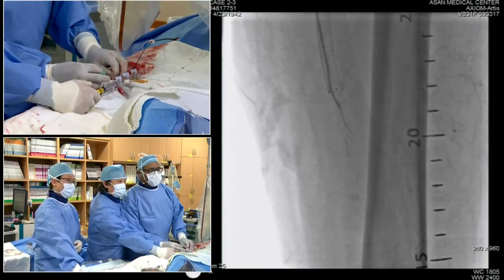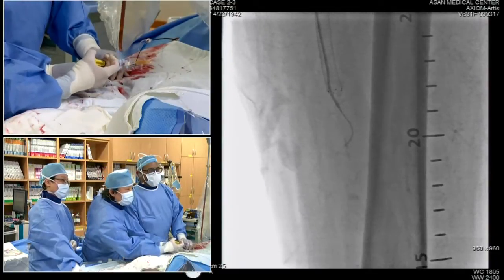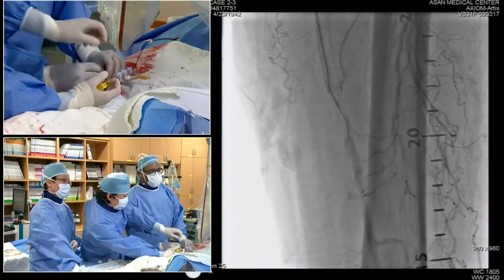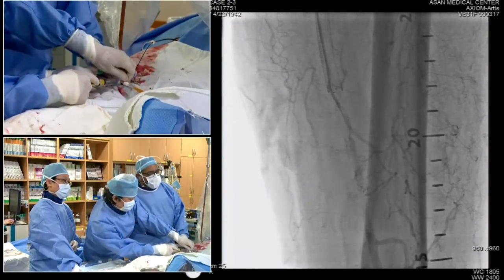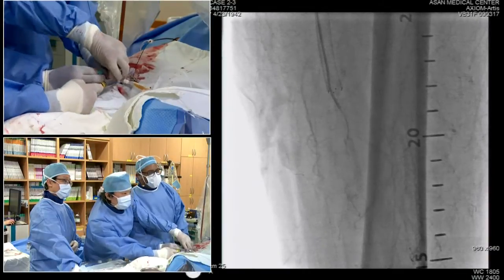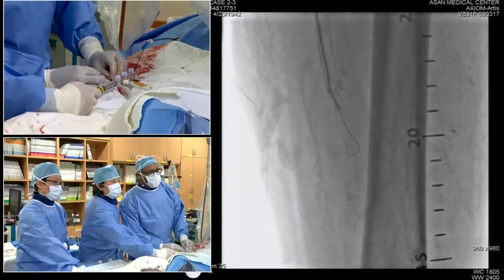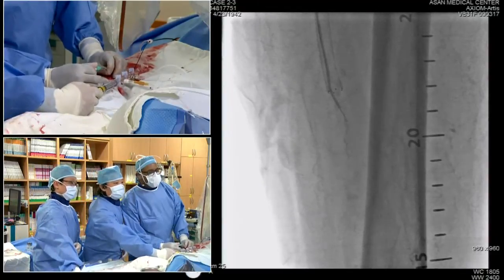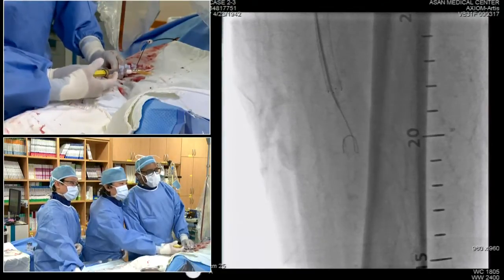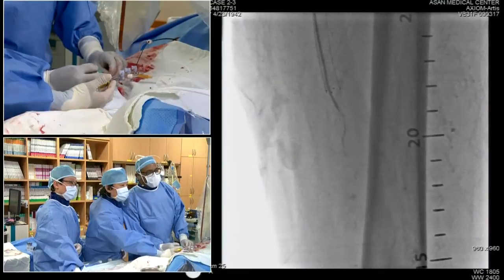I think if you're going to stent a subintimal recanalization, you need to stent the whole thing so you avoid this type of problem, or at least stent the entry and the exit. What would you like to try? Because for me, in my practice here at this point, I would have a very low threshold of pursuing a re-entry device, but that's not an option here. As the longer we go here, we don't want to extend this too far. We are always going to stent this.